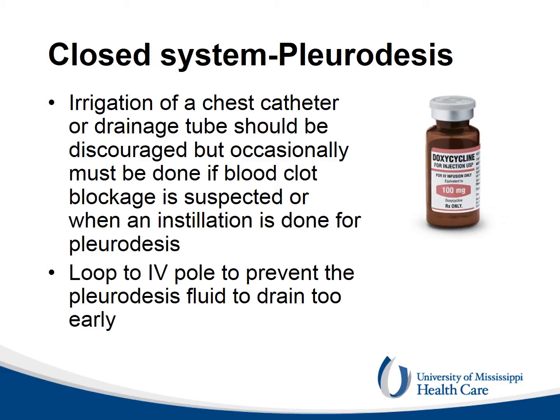The fluid should stay inside the chest cavity for 1 or 2 hours, and the tube should not be clamped, but looped on an IV pole. This way the fluid will not drain, but the air can escape from the pleural space into the drainage system.